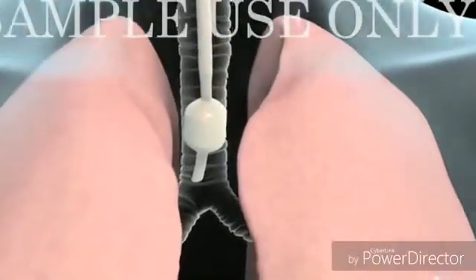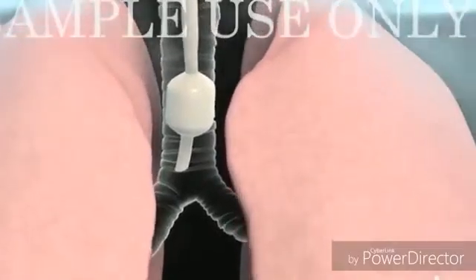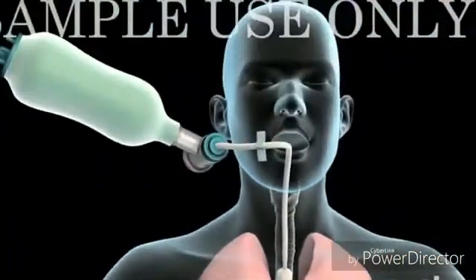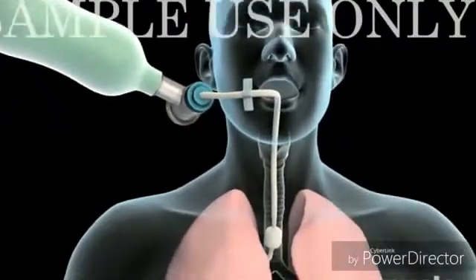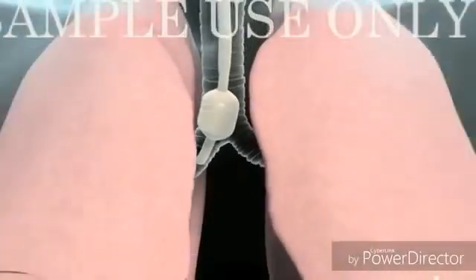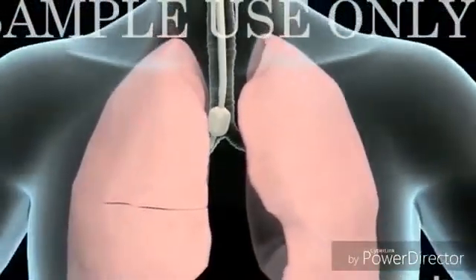After fixing the endotracheal tube, the air entry in both the lungs is checked with the help of the ambu bag. The expansion of the lung on both sides is observed.